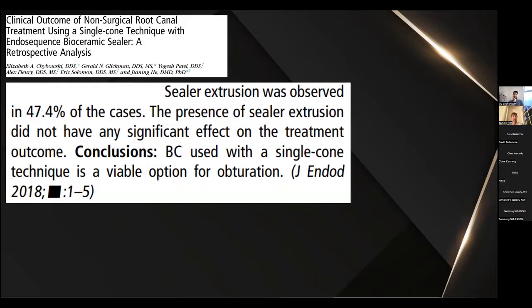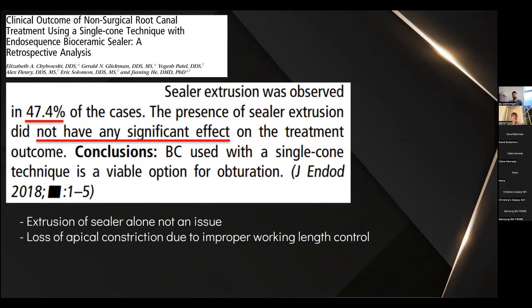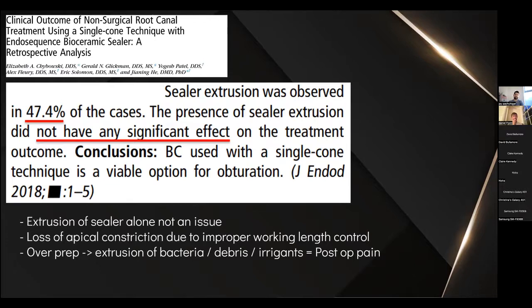So this was a study that they did. I think this was all by endodontists who were new to using the bioceramic sealer, and what they found, I think they did about 300 teeth here, was that in almost 50% of cases they would extrude that sealer, but it had no significant effect on the outcome. But what that really means is the extrusion of just a bioceramic sealer is not the issue. Extrusion often comes with the loss of your apical constriction, generally due to incorrect working length. So what that means is you tend to over prep the canal. You do get extrusion of bacteria, debris, and irrigants, and that's what leads to the post-op pain.